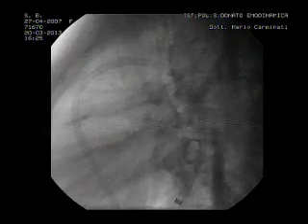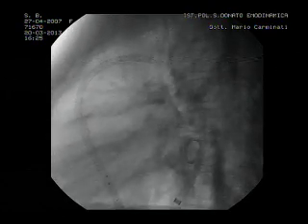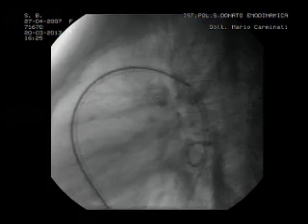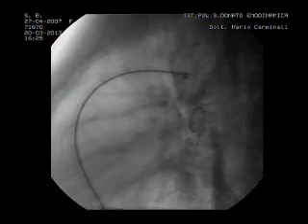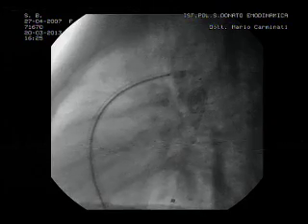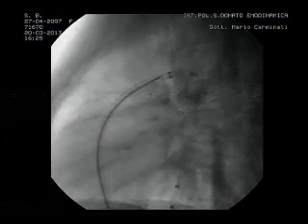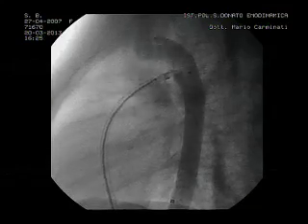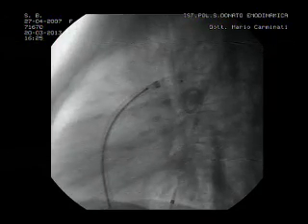Let's see fluoroscopy now, please. Okay. All right. I'm advancing the device through the sheath. Here we go. Pull the system back. Release the disc in the aorta. Can you do a quick angio here? You're far in the aorta here. Pulling more. Do another angio.